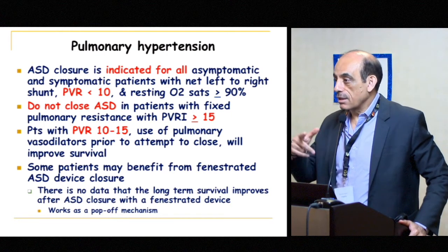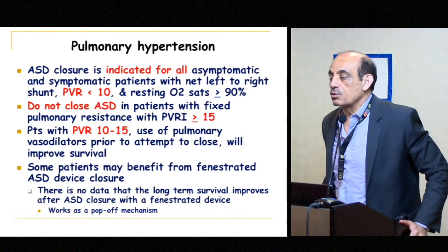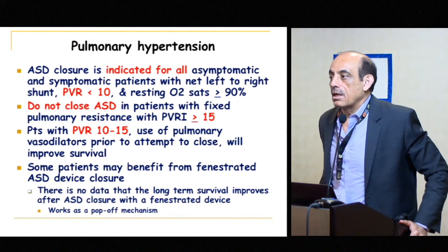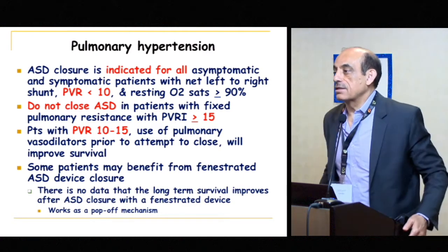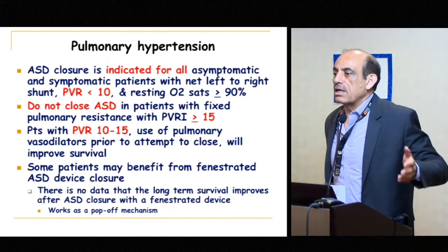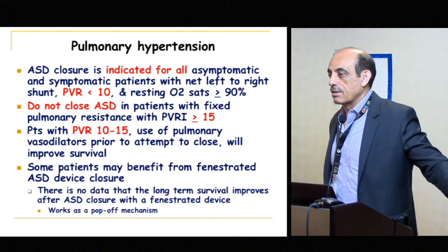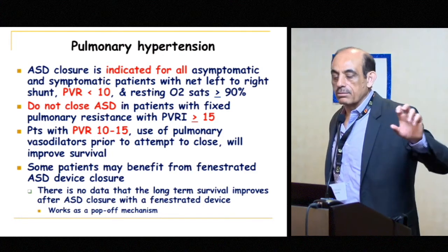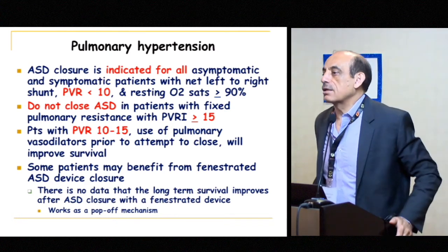If it's a very thin aneurysmal septum, I will balloon size. If there is clearly evidence of two defects, I'll balloon size. But if the defect is a single defect, especially in children, I will not balloon size, because you can make a defect that is easily closable, not closable, by doing balloon sizing and making it so big that you start thinking, I cannot close this defect.